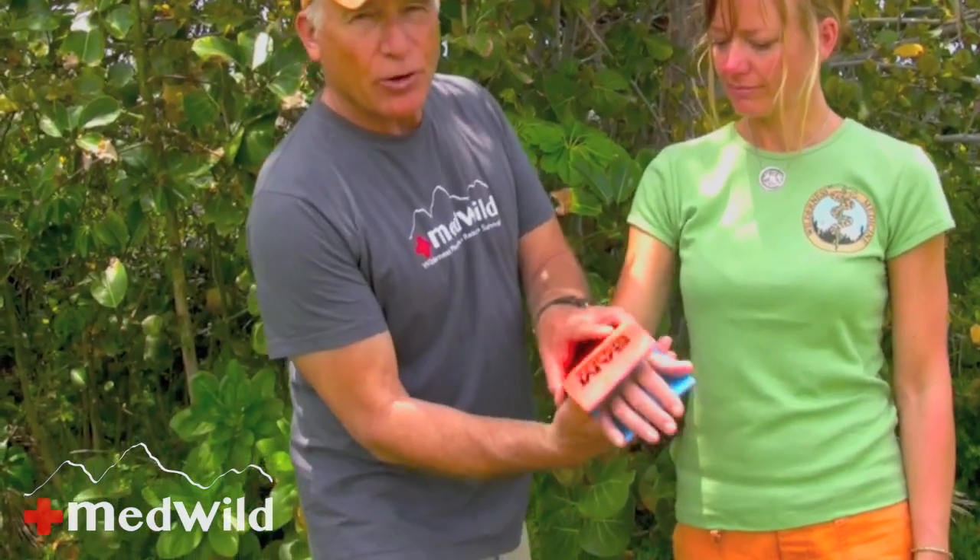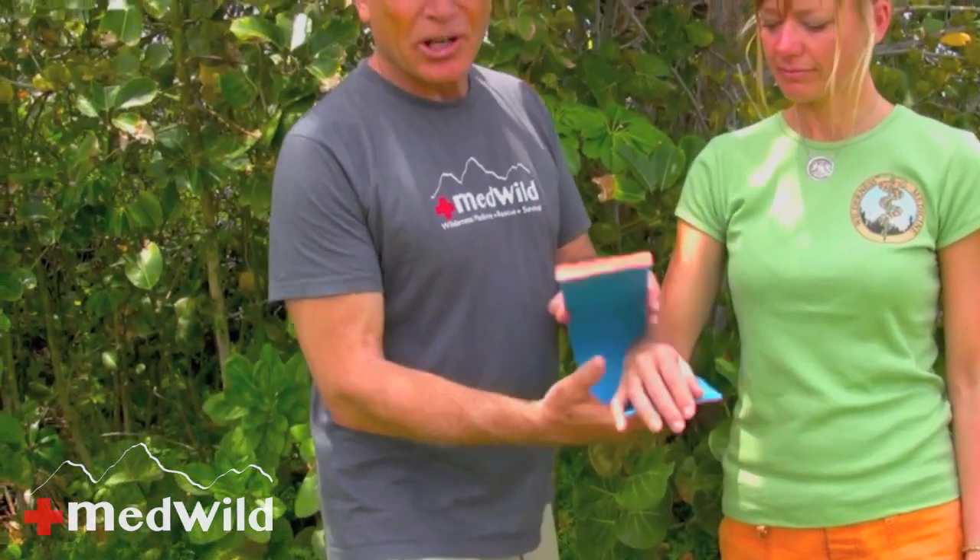The first thing I like to do is approximate the fitting to the patient. If you've got a patient with a real broken arm, it's going to be really painful to figure out how to put this on over the injury. So I usually try to find a friend of similar size and approximate the fitting on a non-injured patient, or on the non-injured arm, or if it's someone about my size, I could form it to my own arm first and then transfer it to the patient with a minimum of manipulation.